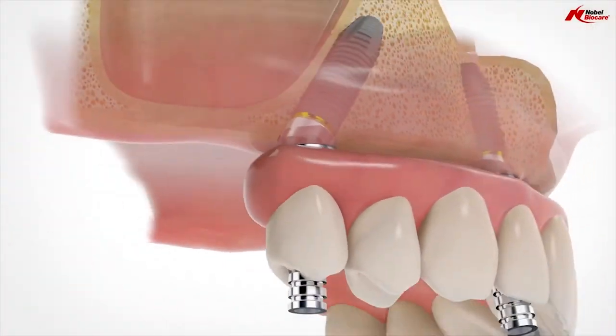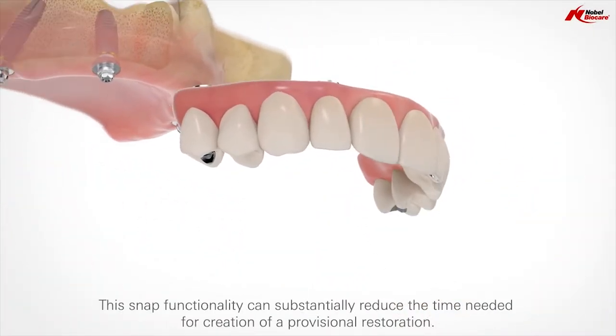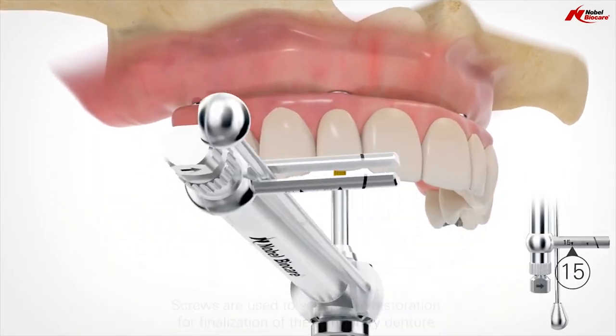Four implants are placed into the bone, and then a set of teeth is anchored or screwed in to these implants. This replaces having to take a denture in and out of your mouth. Now we have something that's stabilized, that doesn't have to be removed at night, something that you can clean inside your mouth, and something that you can eat foods with confidence again.